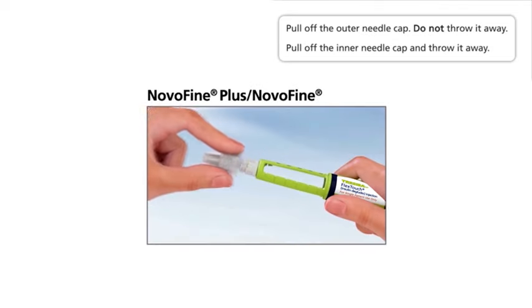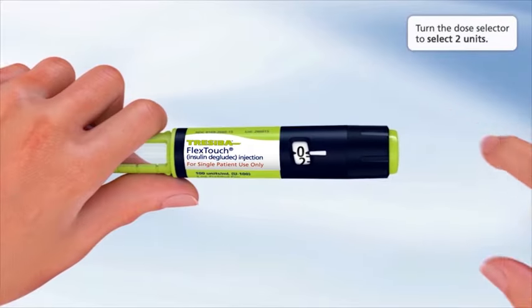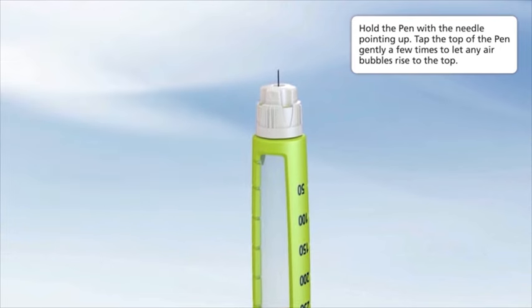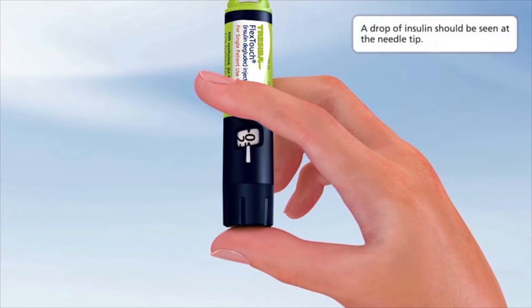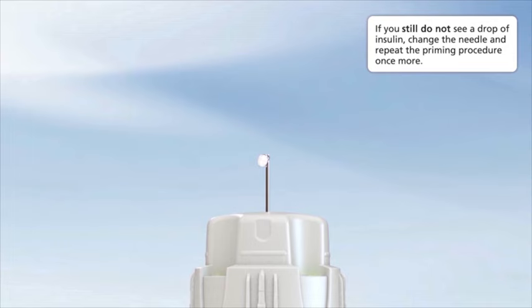Pull off the outer needle cap — do not throw it away. Pull off the inner needle cap and throw it away. Press and hold in the dose button until the dose counter shows zero; the zero must line up with the dose pointer. A drop of insulin should be seen at the needle tip. If you do not see a drop of insulin, repeat this priming procedure no more than six times. If you still do not see a drop of insulin, change the needle and repeat the priming procedure once more.